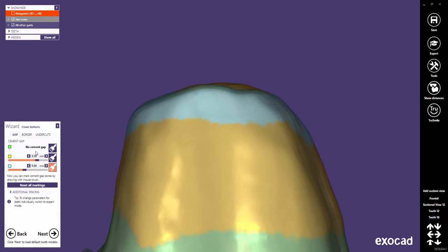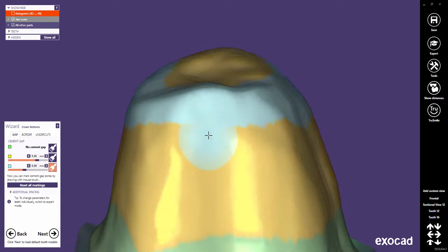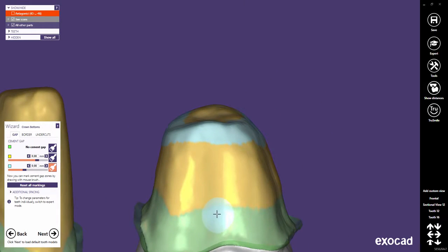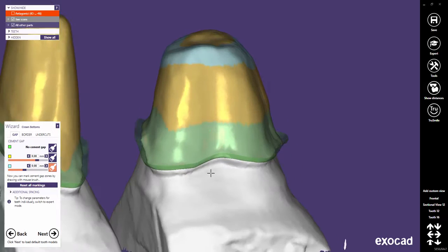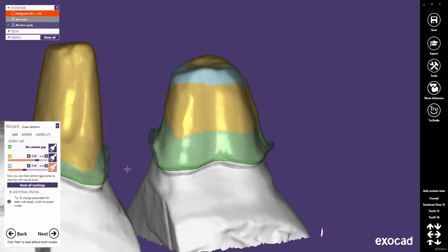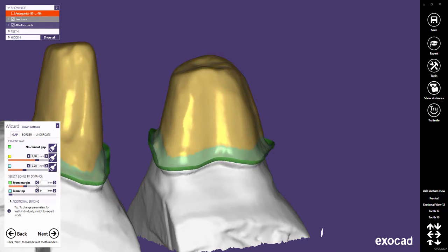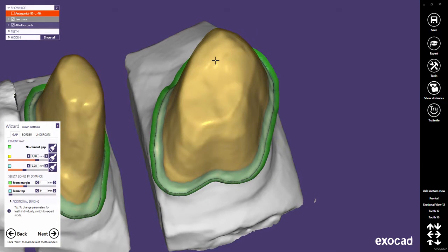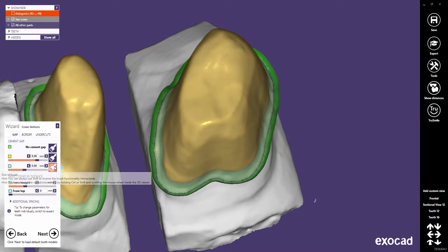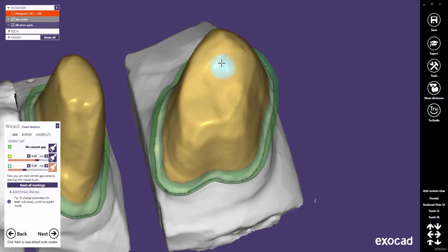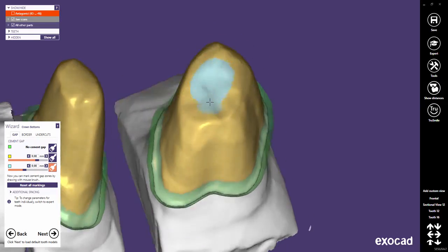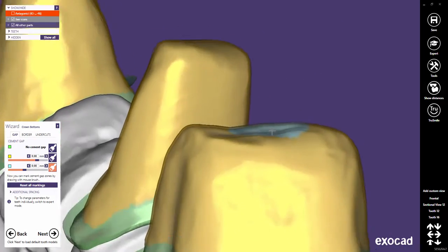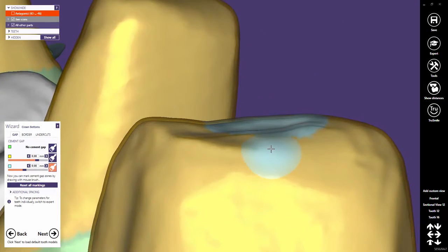Also here, you can use Shift to delete brushed zones. You can also reset all markings. Some people might want to use the additional zone as a cement gap end with no spacing to avoid the rocking of big bridges.